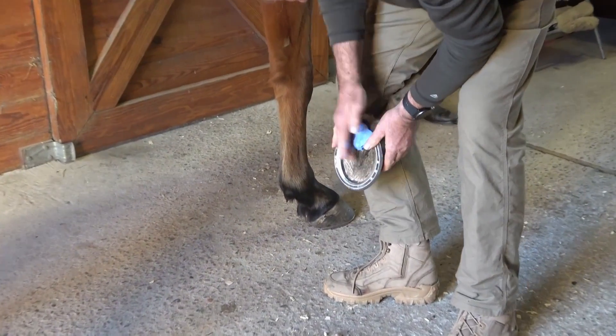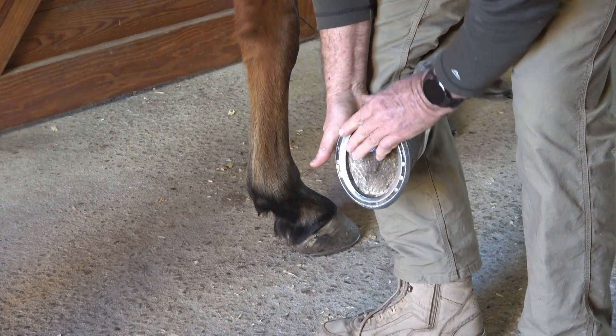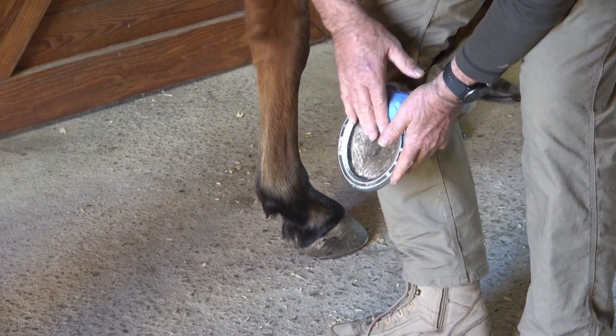After mixing the impression material thoroughly, place it in the back part of the foot and distribute it as illustrated. You can mold it up over the heel bulbs if you like and form it into the frog as desired.